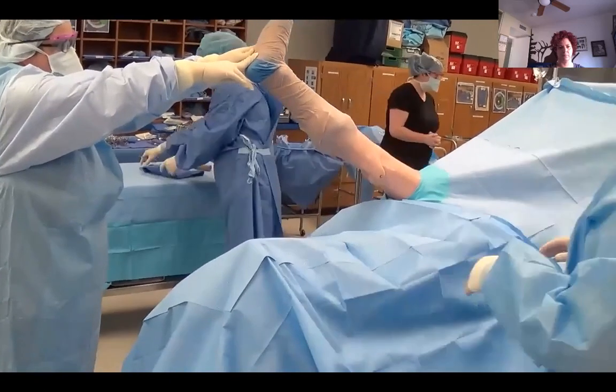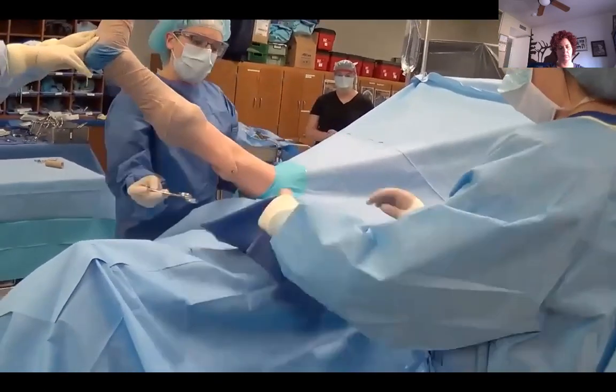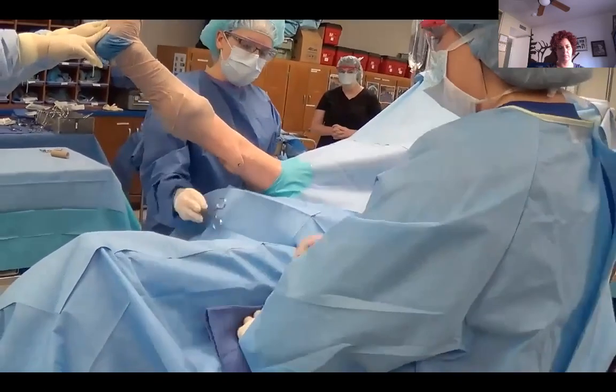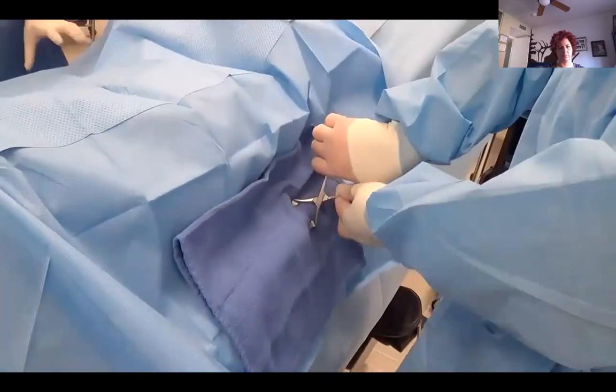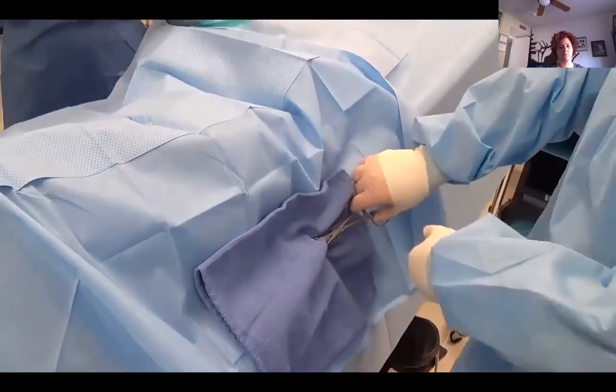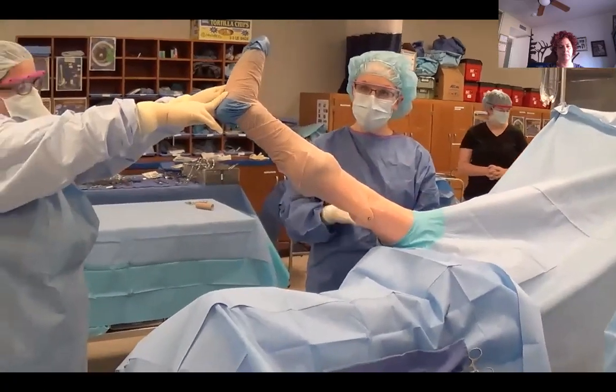And then because we tend to move the leg throughout a range of motion during the case, on the unoperative side of the field, we will place a towel and a non-perforating towel clip and clamp the drapes to the mattress on the OR bed, which as we move that leg, then that will help to prevent the drapes from shifting from an unsterile level to a sterile level.